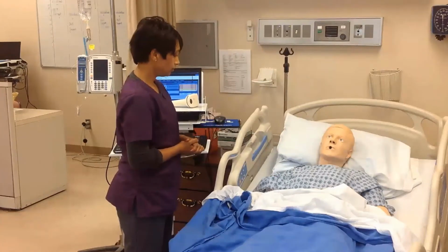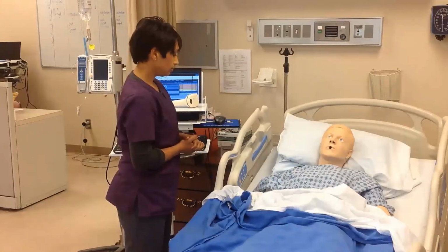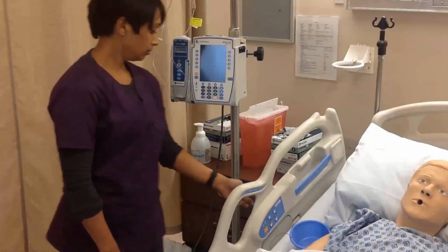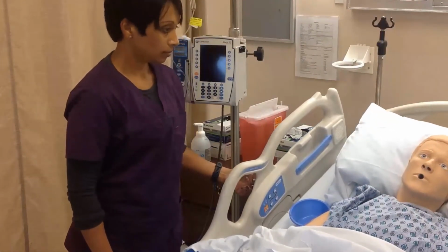Check his blood pressure and pulse and auscultate his lung sounds for crackles in the bases. Explain the procedure to the patient and provide for privacy. Raise the height of the bed to a working height and put the side rail down on the side you will be working.